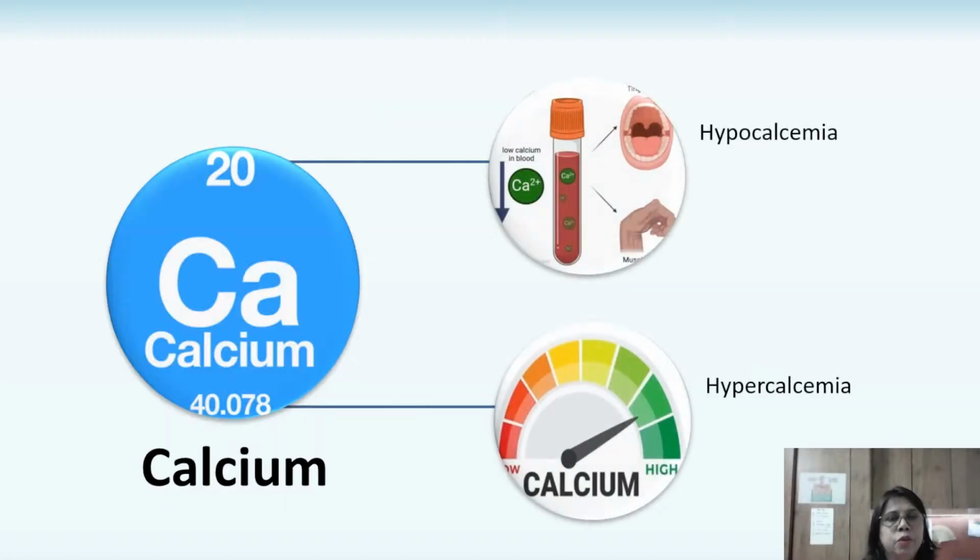Calcium must be added to the replacement fluid and dialysate during CRRT to maintain a normal ionized calcium range. Augmented calcium levels may be required if patients have hypocalcemia, and reduced calcium levels may be required if the patient has hypercalcemia. When citrate is used as an anticoagulant during CRRT, then very low or little calcium should be present in the dialysate or the replacement fluids. And in order to supplement this low calcium level, intravenous calcium is infused to replace the losses in the effluent.